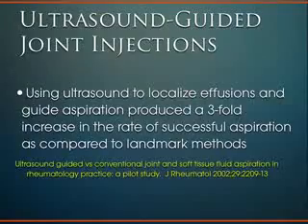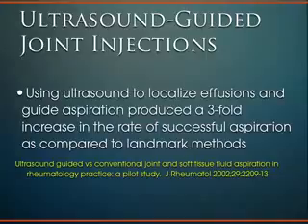So I mentioned earlier in terms of the application of ultrasound in the office, one of which is using it for image guidance or for joint injections. And we've been doing joint injections for a long time using surface anatomy and your knowledge of that surface anatomy to guide your injection and identify the joint space and identify the tendon sheath and identify your soft tissue structures.